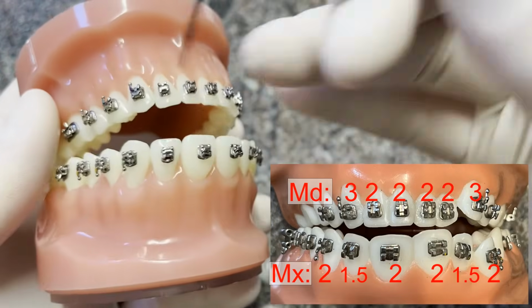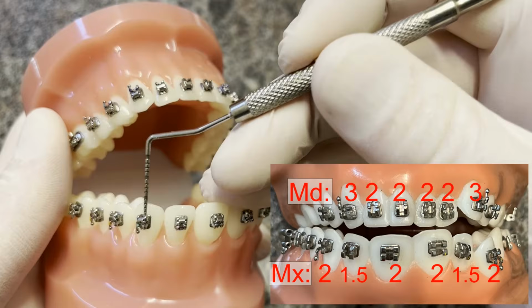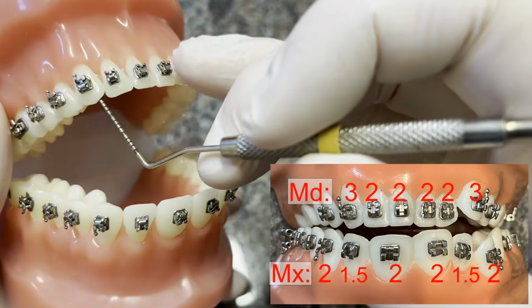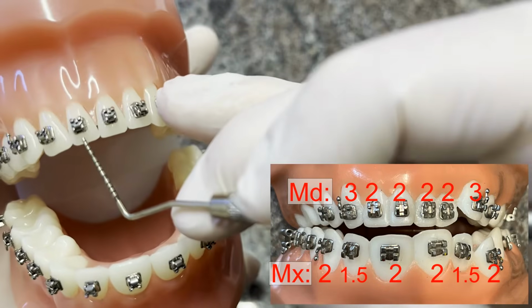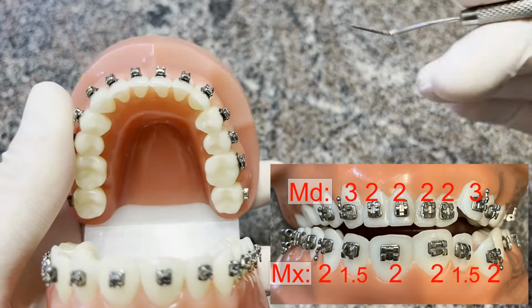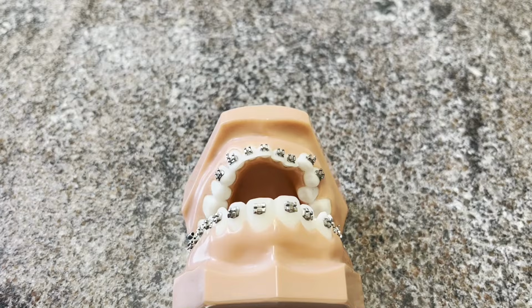So height-wise, on the upper 3s, it goes top of the 2 millimeter line, 1.5, bottom of the 2 millimeter line. On the lowers, it goes on the canines 3 millimeters, and on all the incisors about 2 millimeters, roughly. And then the doctor will come and perfect the positioning as best they're able.